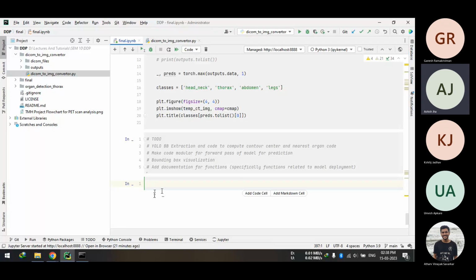SUV mean is the average of SUV in that tumor region, and then you multiply it with the volume of that tumor. So you have to calculate the volume, calculate the mean SUV, and multiply the two. Okay, what is mean SUV? Mean across the patient or mean across the lesion? Across the lesion. Okay. So what is the formula again? I will send you the formula for everything.